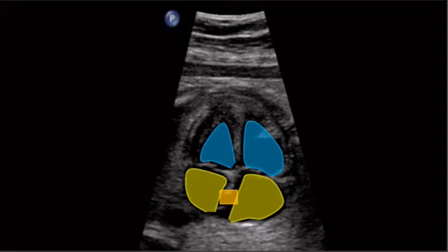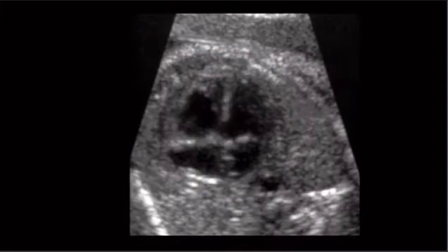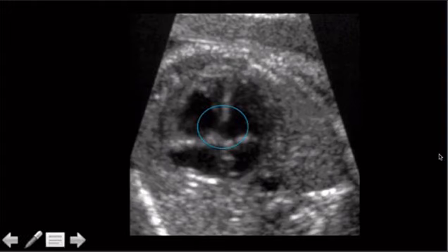I don't think, I mean, if they could ask, they would have to tell you one or the other as distractions. They couldn't list them both. What they can show you is this. Orienting yourself again: muscular part of the heart, ventricle, atrium, and notice there's the hole. That's the hole there. So that's a VSD, right? That would be easy to show. That would be fair game.